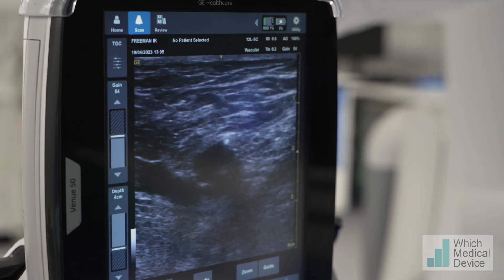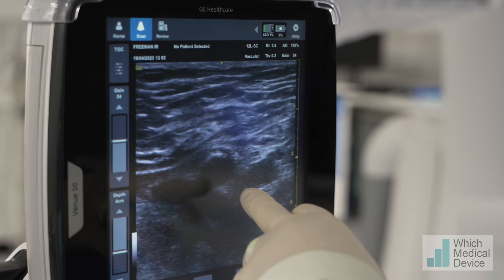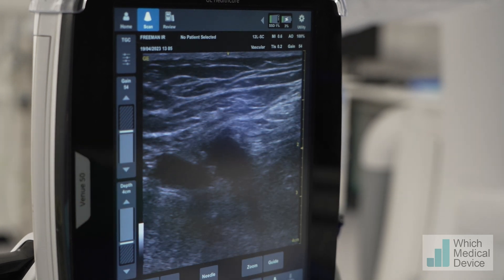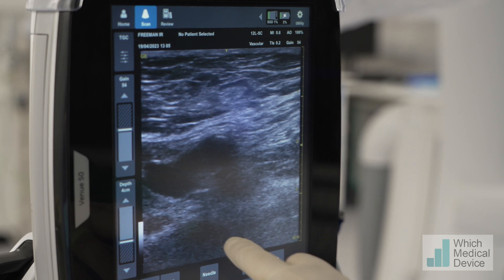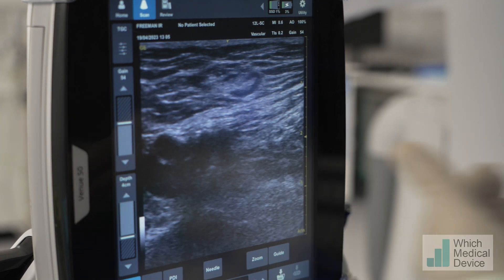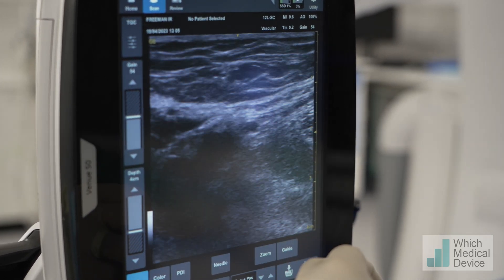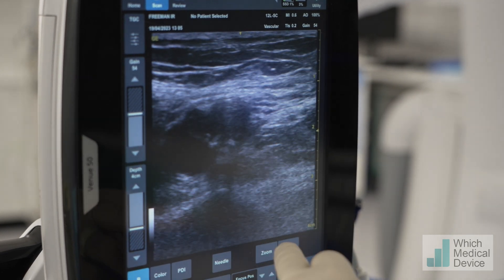The bifurcation is the splitting into the profunda, which is this one here, and the SFA, which has a bit of calcium on its anterior side. Ideally the puncture site should be on top of the femoral head, which is basically this bright structure just here. If I go towards the pelvis, the artery should dip down into the pelvis - which you can start seeing here.